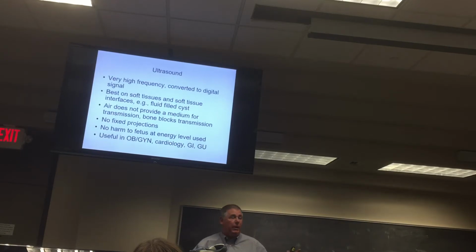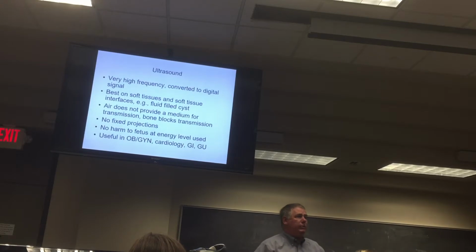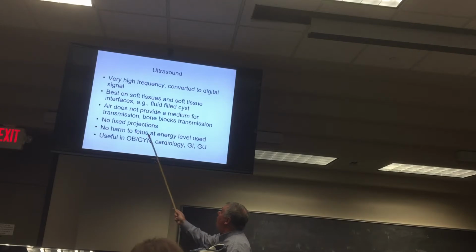It's ultrasound, and because it's non-ionizing, and at an energy level that's so low, you can use it in obstetrics. Usually OBGYNs will say that 2 ultrasounds during a pregnancy is the max, but really, there is no max. Usually 2 is all the insurance company will pay for, which is why it's the max. But you can do an ultrasound every week if you wanted to check on things. So it's no harm to the fetus at the energy level that's produced here.